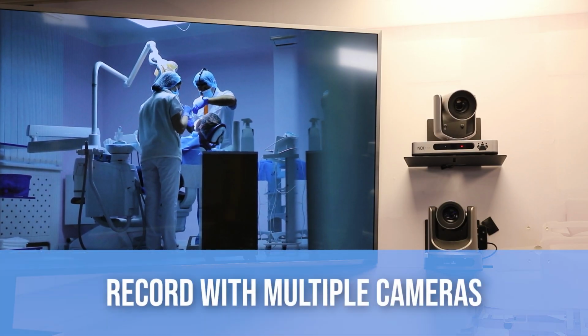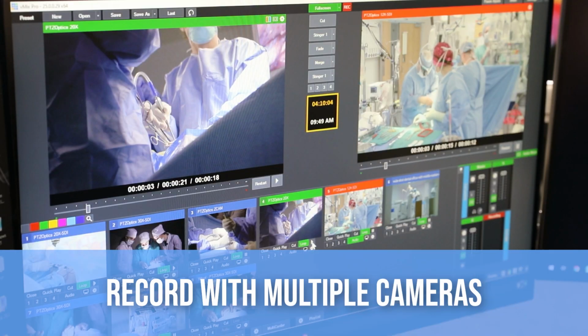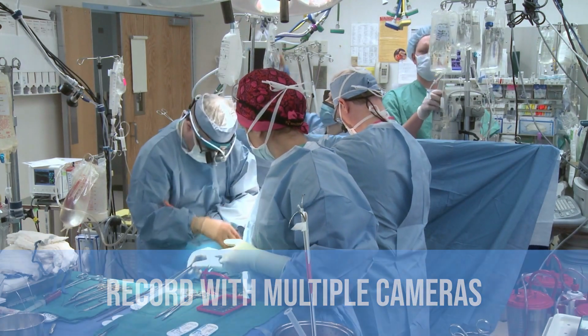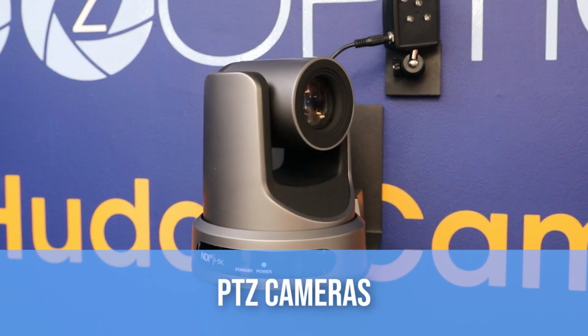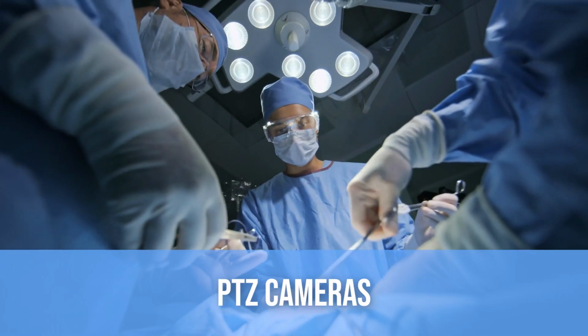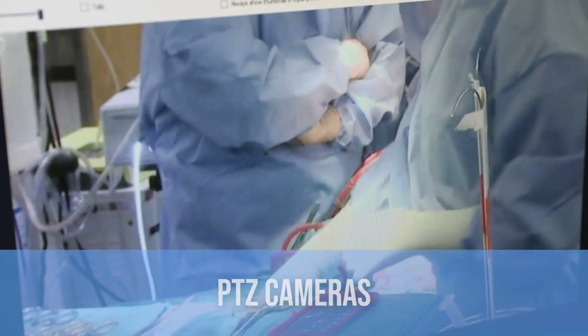The system is also able to record multiple cameras at the same time, along with a master channel that focuses on what the instructor chooses. The system will also demonstrate PTZ cameras, which will allow instructors the ability to zoom into specific areas of interest.